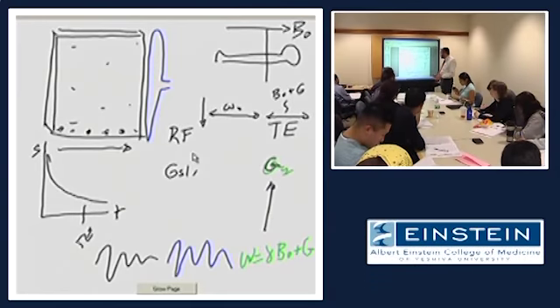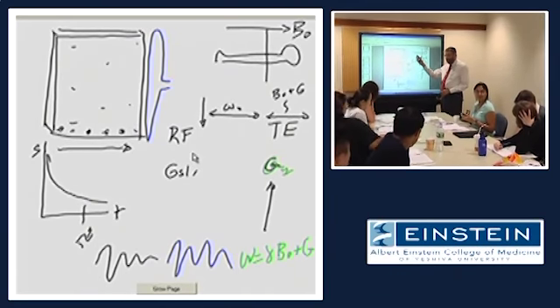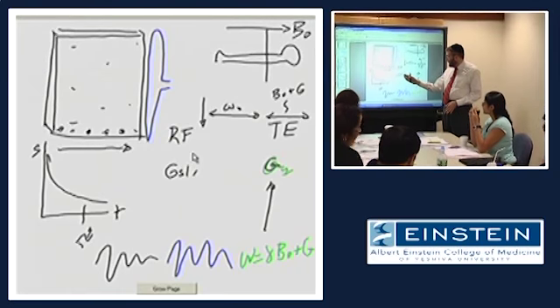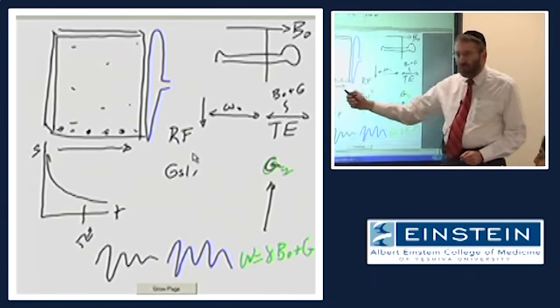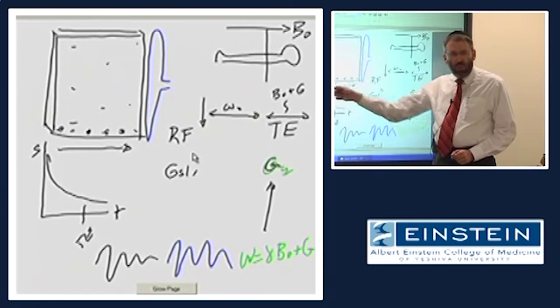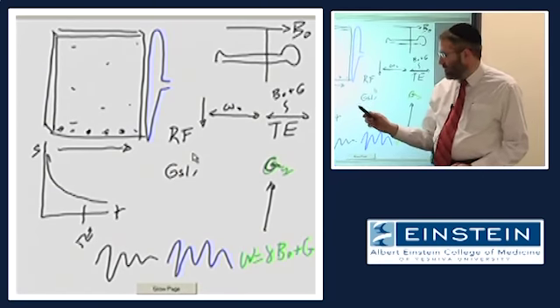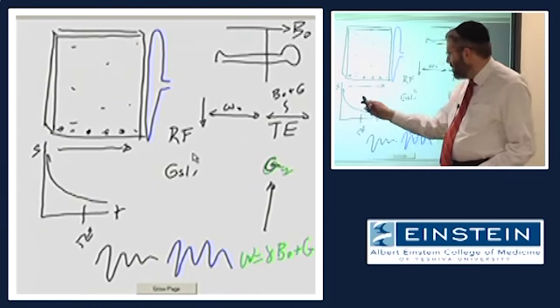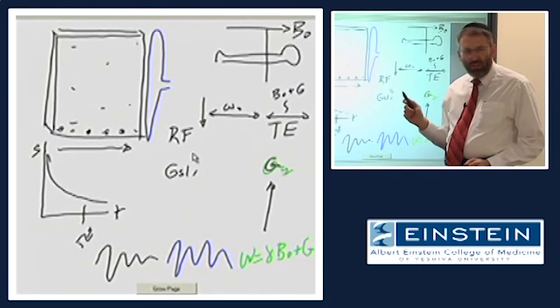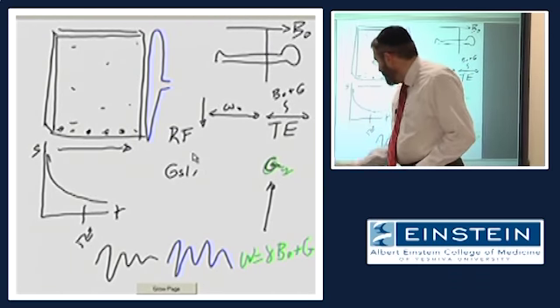Where we are at this point is that we've put the patient in the scanner, excited the slice, and then during the time that we sample the signal, we have a gradient magnetic field on across one of the in-plane dimensions. Now just to clarify one thing that someone asked me during the break. I drew this gradient magnetic field as a flat horizontal line, which may have been a little bit deceiving.